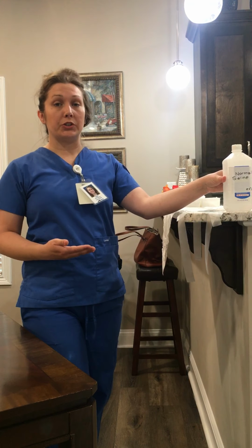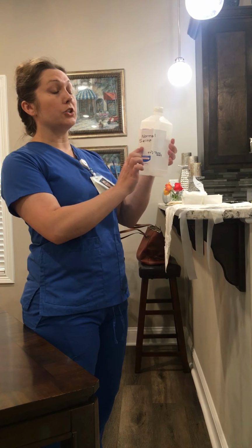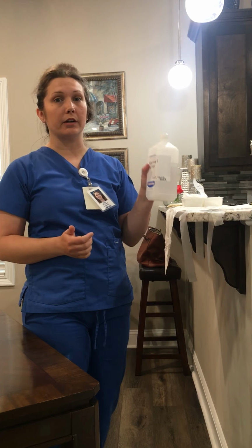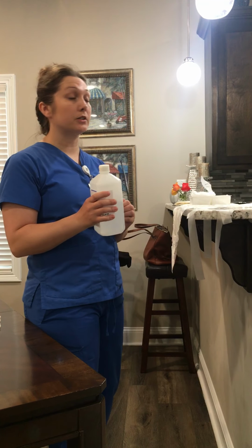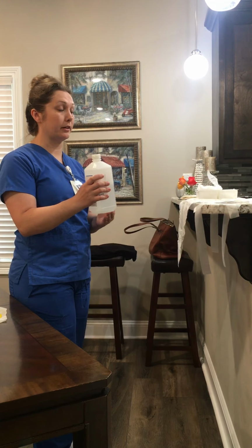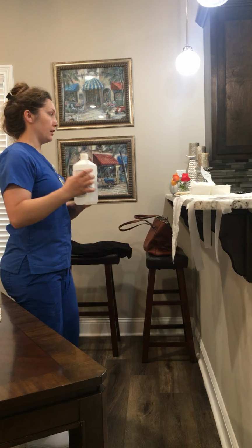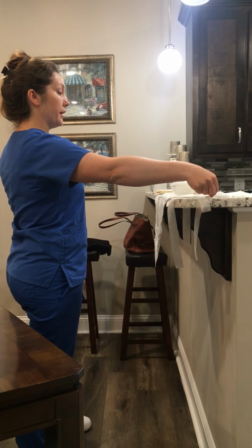I also need to add some normal saline, which is the cleanser for this procedure. You always want to make sure that you have the right cleanser. Not every procedure is going to have normal saline. So this is normal saline, and you want to make sure that it's not expired. So this says it expires June of 2023, so we're good. You want to place the label in your palm, and again, when I put it into my sterile field, I want to enter at the point of entry where it's going to be least contaminated. So I see a spot right here. I'm just going to pour it in and then set this aside. And then I'm just going to pull this sterile field over here just a little bit.